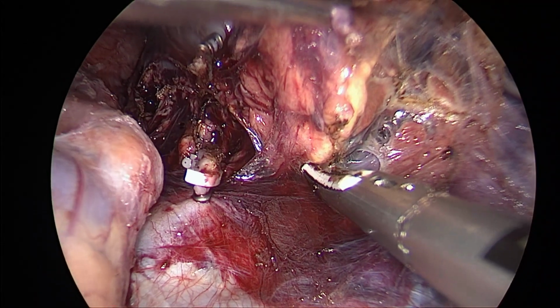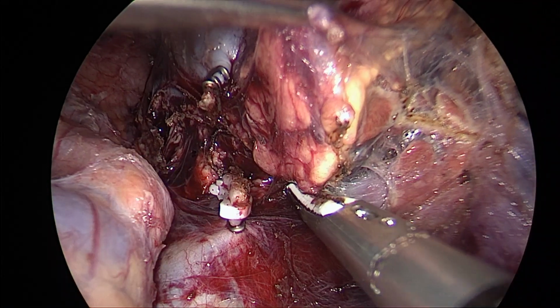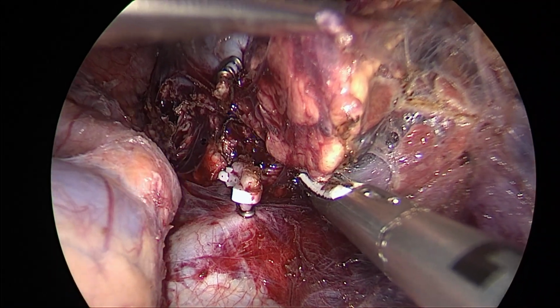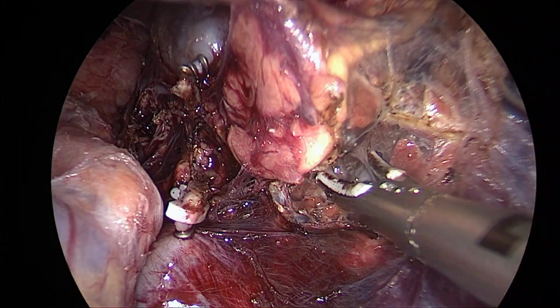The adrenal gland was entirely separated from the retroperitoneum. Especially in obese patients, this step can be particularly tricky due to the excessive perirenal fatty tissue.